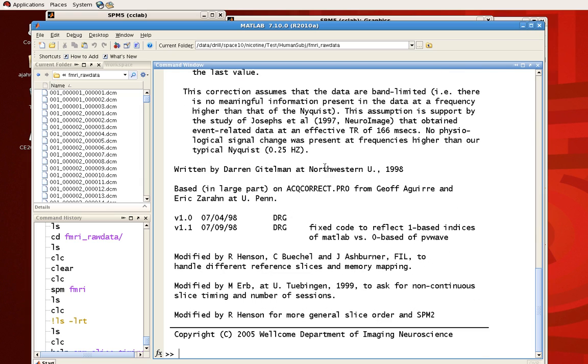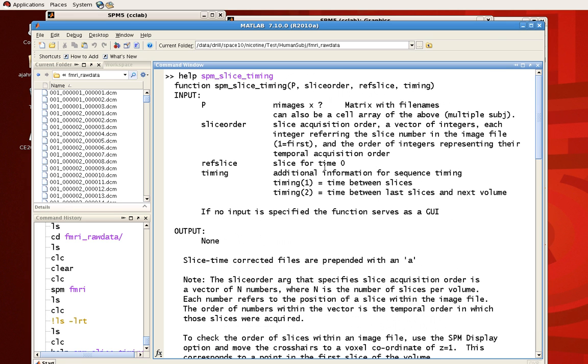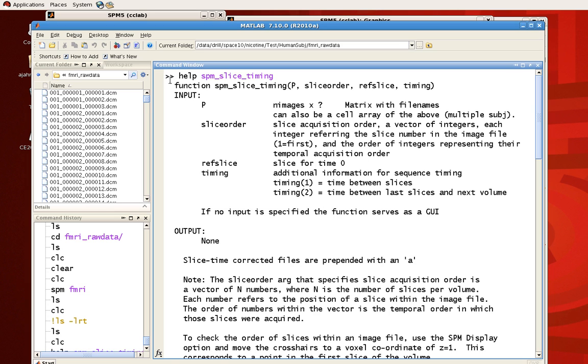So what it needs here, it needs four arguments. It needs p, which is a list of images. It needs the slice order, like we talked about last time. Did you acquire them interleaved? Did you acquire them sequentially? It needs a reference slice to correct to, and it also needs a timing vector. This timing variable has two values: the time between slices, and the time between the last slice and the next volume. So let's cover this step by step. First we're going to talk about p, then slice order, then the reference slice, and then timing.